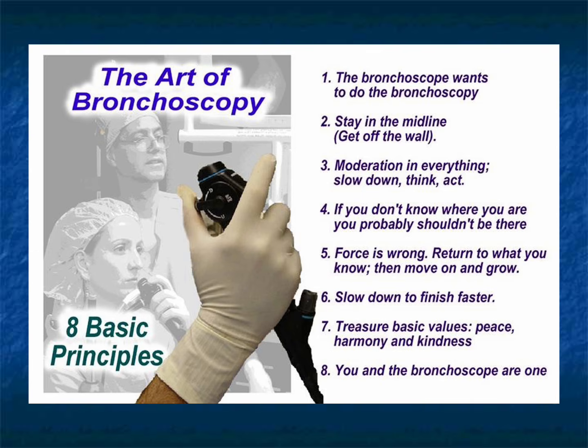The airway must therefore be described in a way that any other bronchoscopist or physician and nurse, and even family members, of course, can understand clearly and reconstruct the procedure mentally. That is one of the hallmarks of procedural maturity.